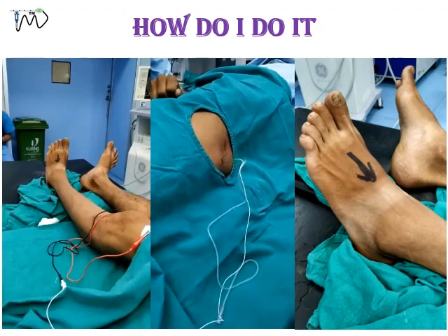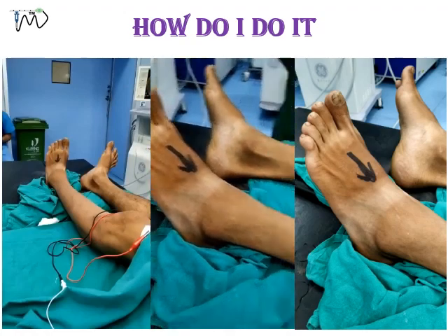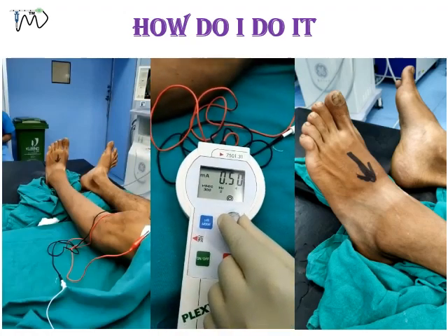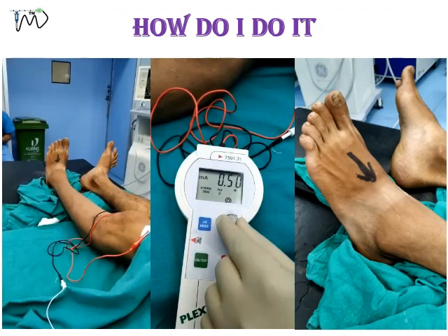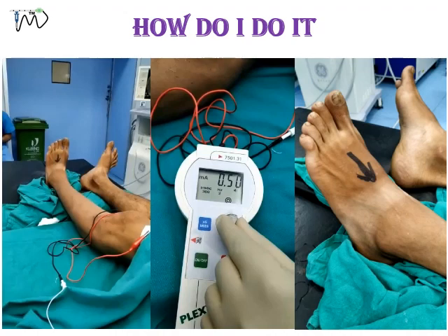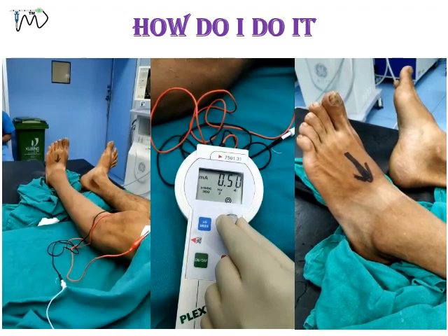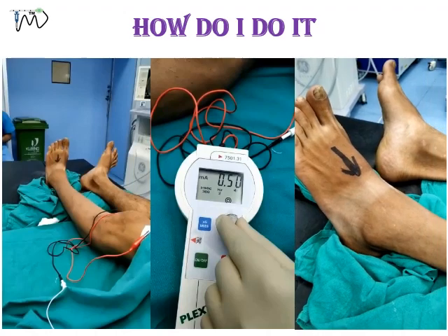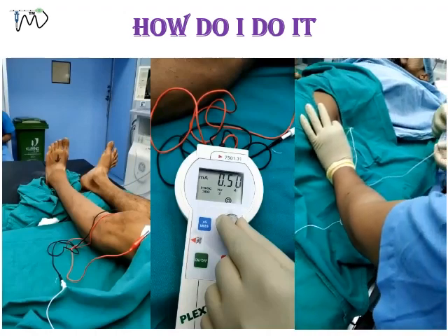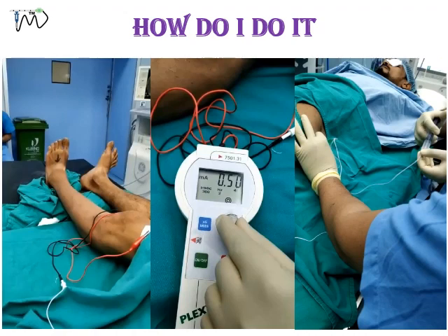One important point: if you are able to demonstrate the tibial component response — that is, inversion and plantar flexion — that is fine. But if you are not getting this at a high sciatic level, eversion or dorsiflexion is acceptable. Going ahead with the injection, with 1 ml of injection it is gone — that is the positive Raj test.